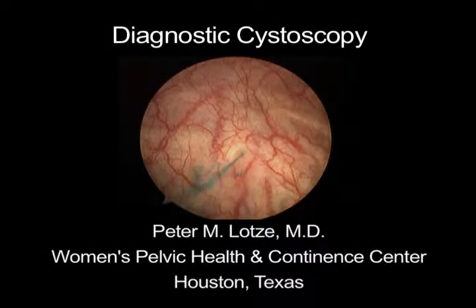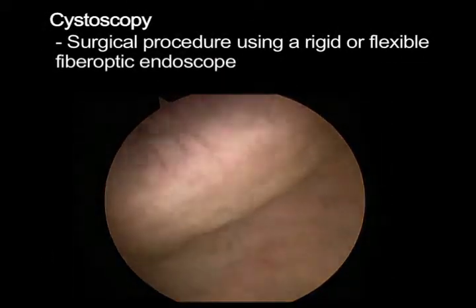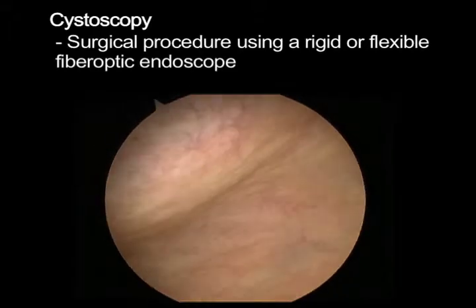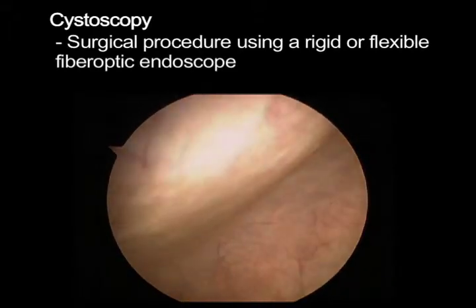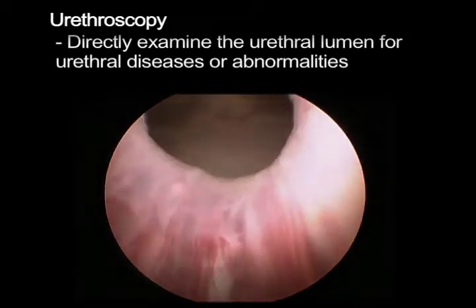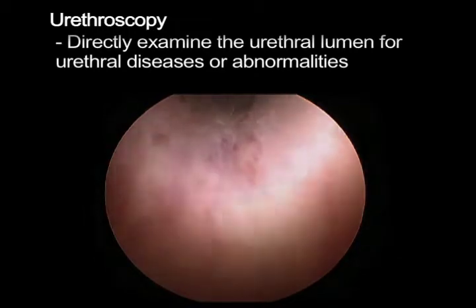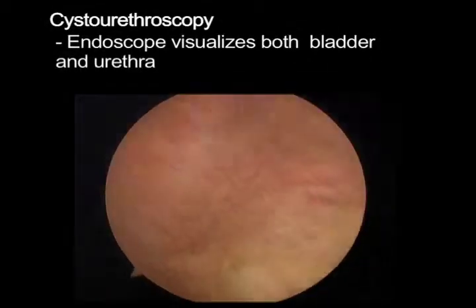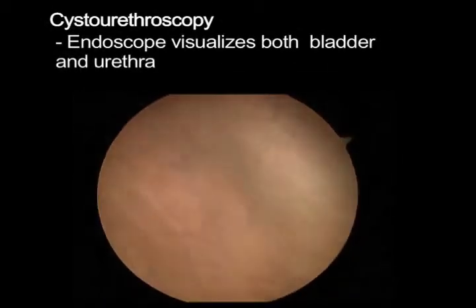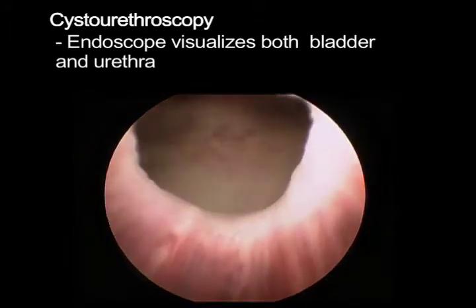Diagnostic Cystoscopy. Cystoscopy is the surgical procedure using a rigid or flexible fiber optic endoscope to examine the bladder. Urethroscopy is a direct examination of the urethral lumen for urethral diseases or abnormalities. Cystourethroscopy is the endoscopic procedure that visualizes both the bladder and the urethra.